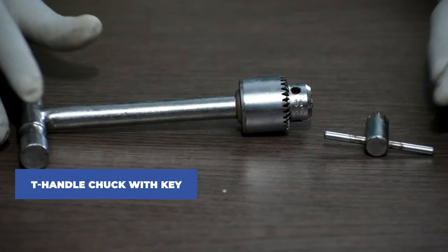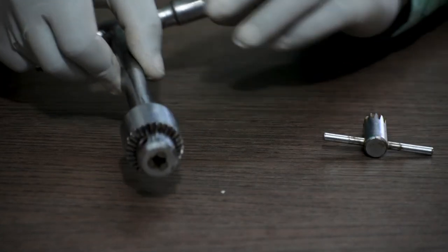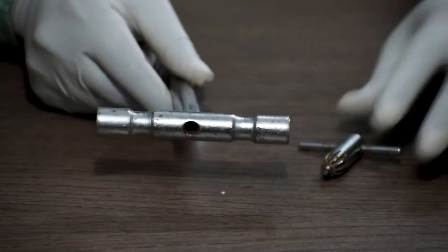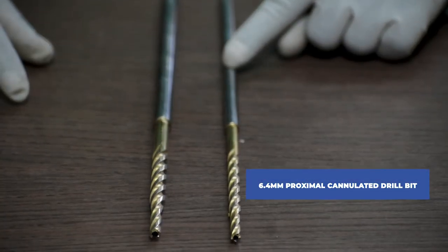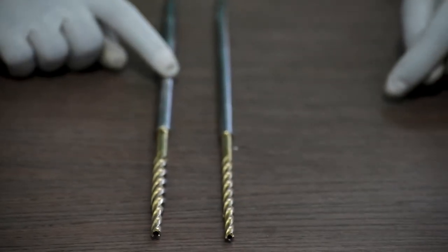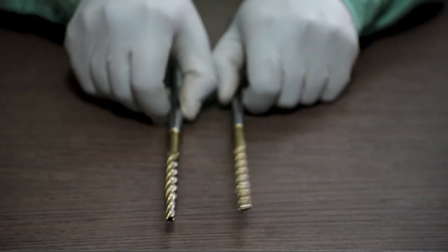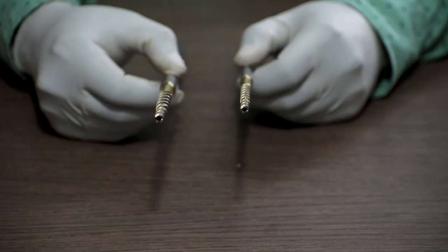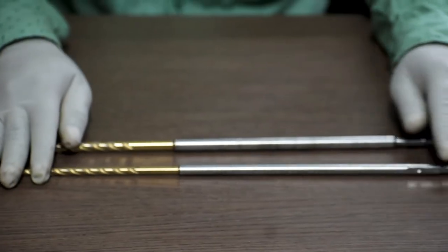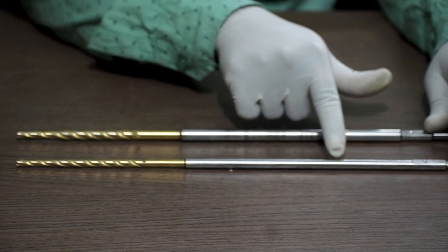Next is T-handle chuck with key. This one is 6.4 mm proximal cannulated drill bit. And this one is 8 mm proximal cannulated drill bit. As you can see, these are cannulated. It also comes with measurement. As you can see, there are markings in the body.